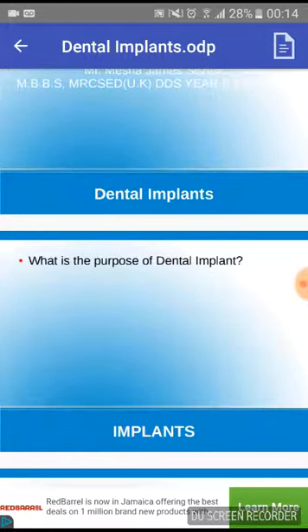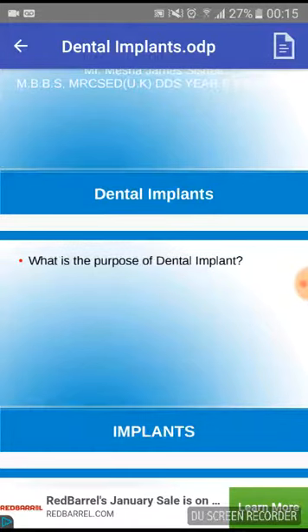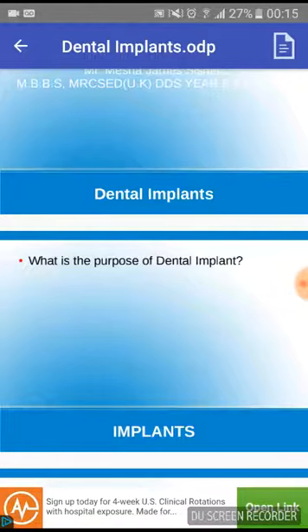So, elastic modulus, what is that? That is the number or a figure that measures an object or substance's ability to resist being deformed elastically. And if you remember, elastically is when you want to stretch a material outwards. So there's an outward or an expansile force as opposed to compressive forces, which represents a force that is required to make an object smaller in size. So an implant must have a good value for its elastic modulus.